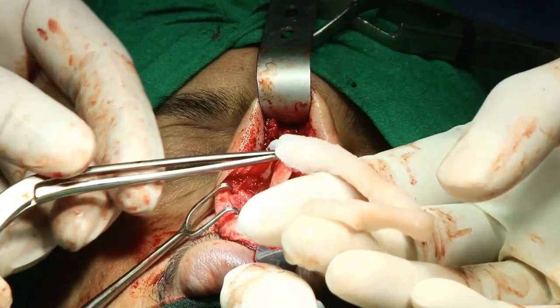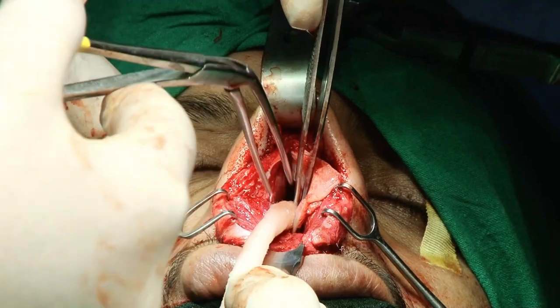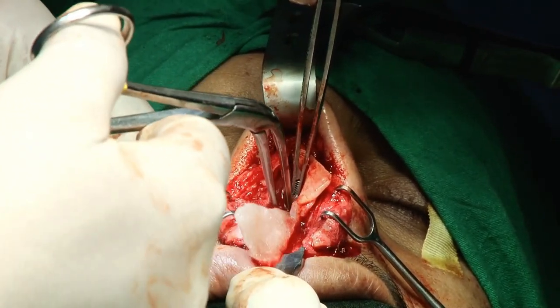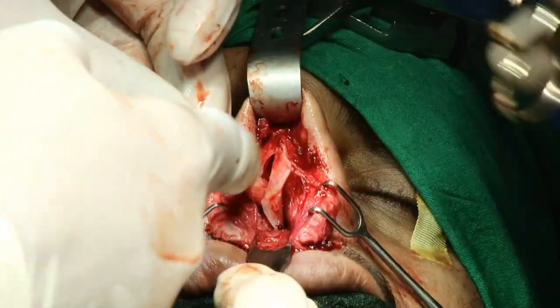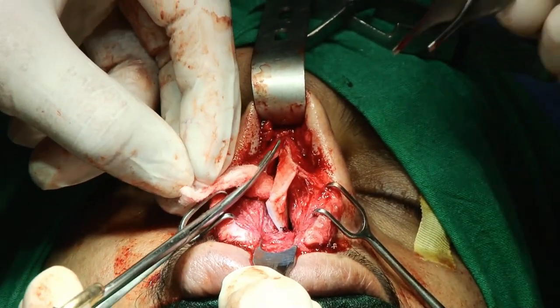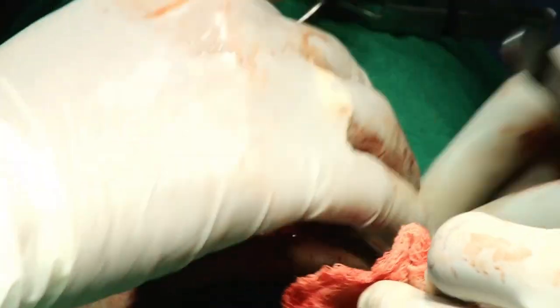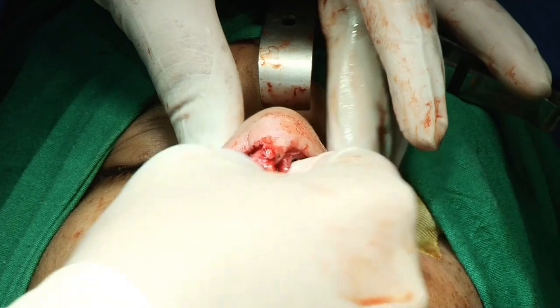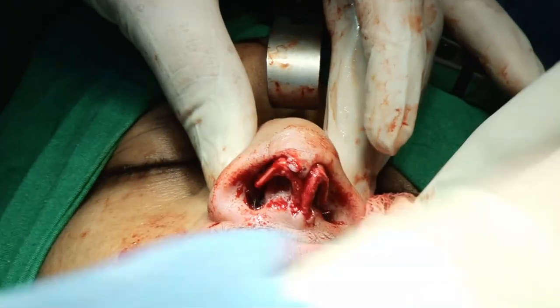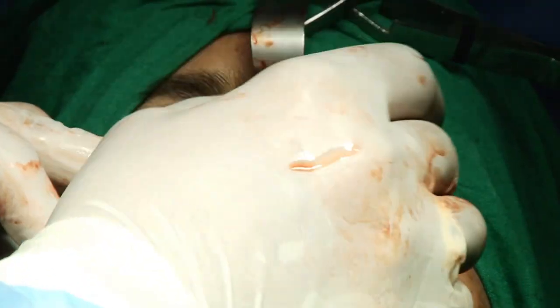So this deviated part, this buckling part, we did after the osteotomy when we reconstruct. So we just put it back, and then first we correct this bony part. Because due to this deviated part, the tip is deviated to one side. Now, after the correction of the septum, we have this little bit.